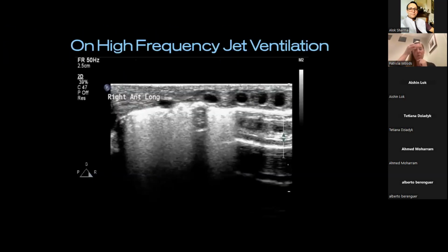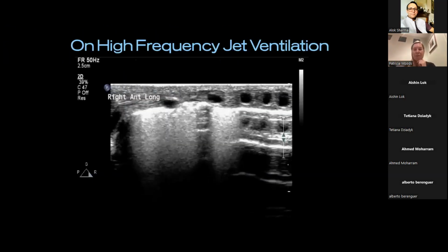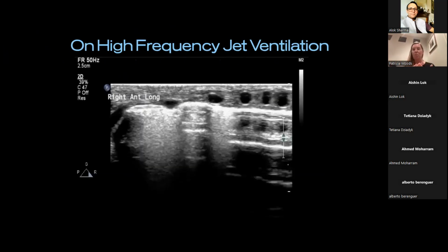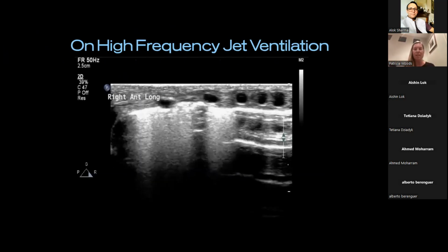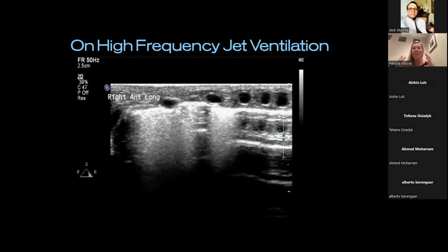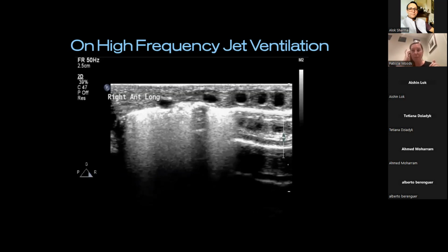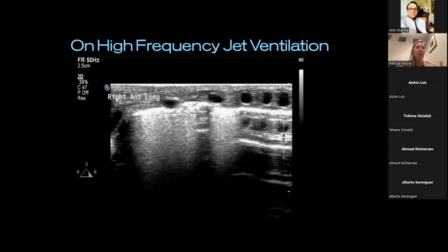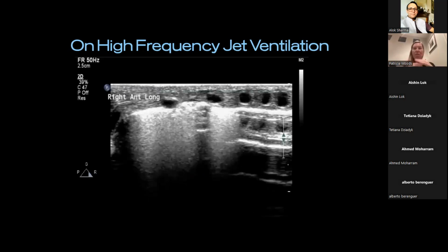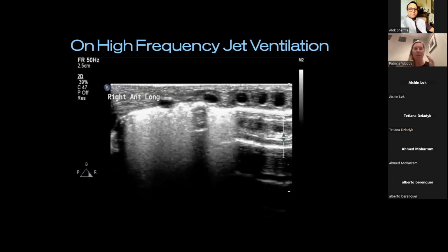Okay, what about all these artifacts on other types? You can have babies that are spontaneously breathing, CPAP support, you name it, what type of ventilator. So a couple of examples to show you. The physics is exactly the same. We have babies extremely preterm nursed on the high frequency jet ventilator here or oscillation. The physics is the same, guys. You're going to see here.